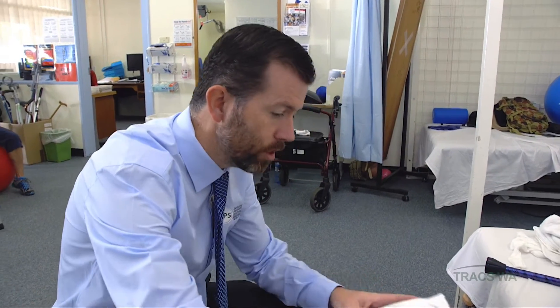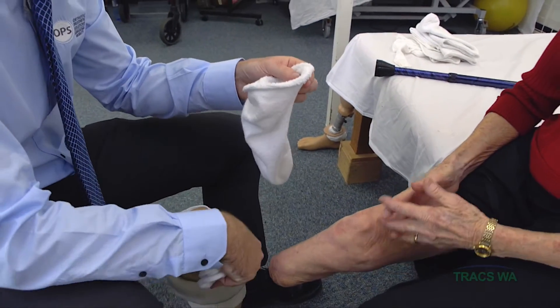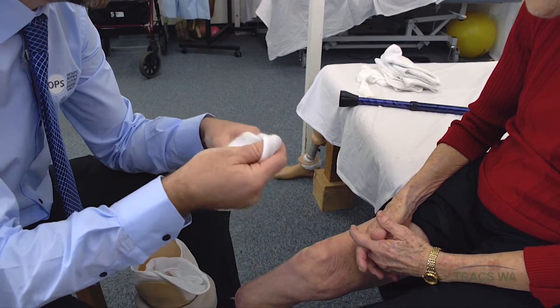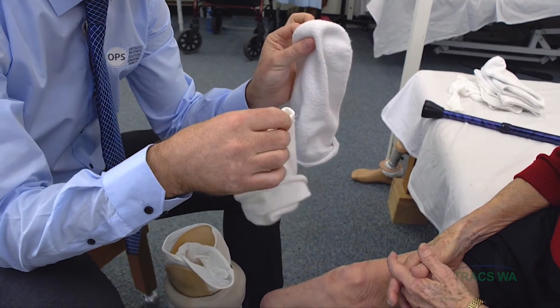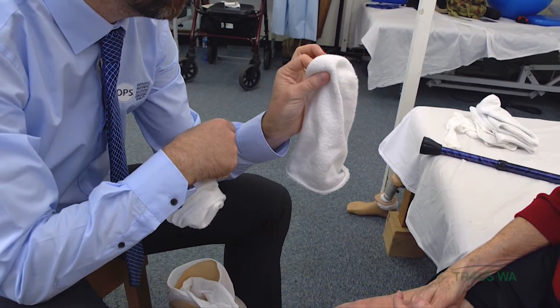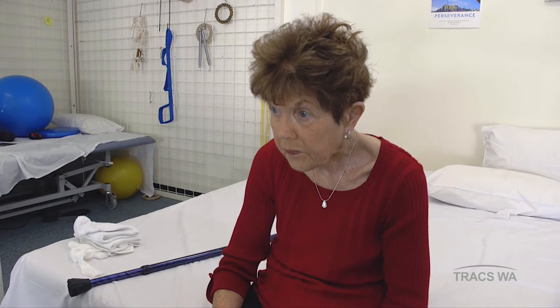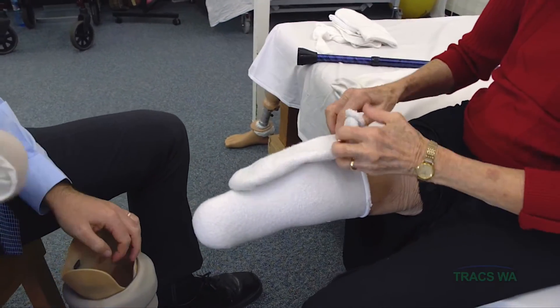Generally speaking, we work most commonly with the thin and the thick cotton socks — the thin sock and the thicker, fluffier sock. We want to incrementally increase the thickness. Just then we were wearing one thick and one thin. To increase that we might go to one thick and two thin, or potentially two thick. You might need to add a sock during the day, or on a particular day you might feel like it's a bit tight and need to reduce a sock, but more often than not it's adding socks.